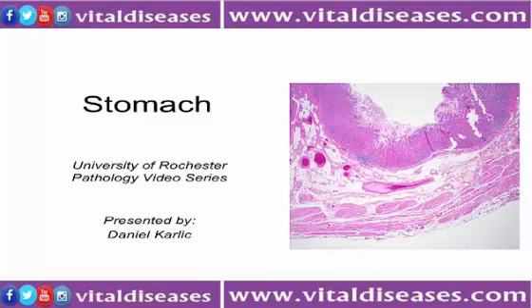This video will review the normal histology of the stomach. The slides that are shown in this video will be available on the U of R Digital Slides website.